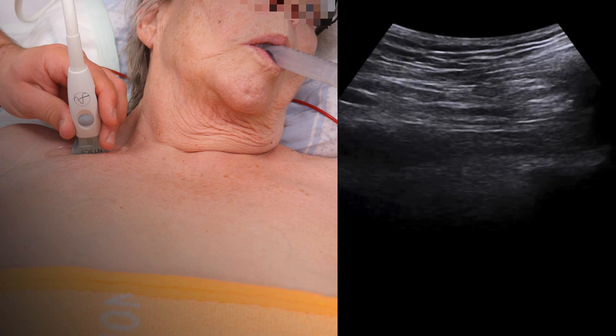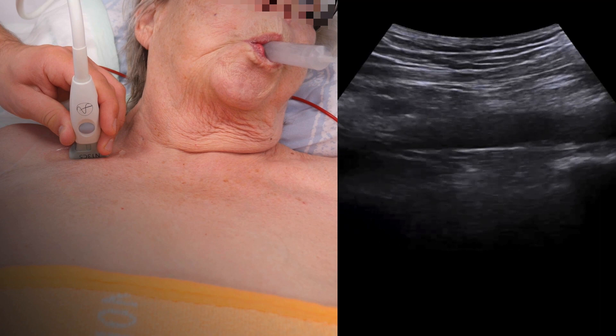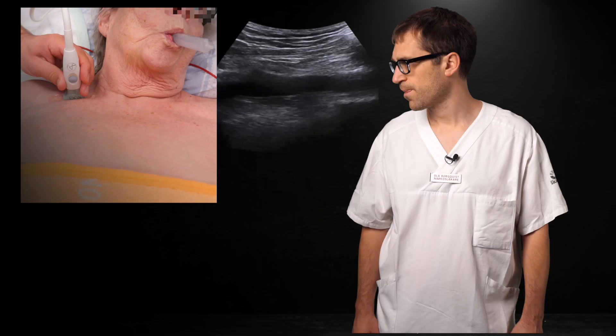Have the patient slowly exhale through the syringe. Now watch this video where the patient has a big artery and no vein in sight. With a controlled, forceful expiration through the syringe, the vein appears. Try this with the next central line you place — it's a game changer.